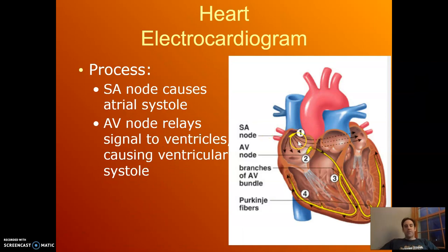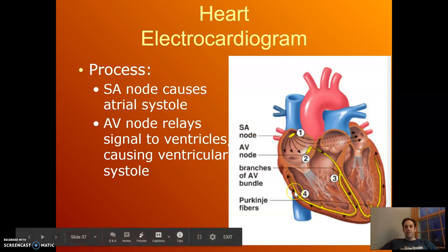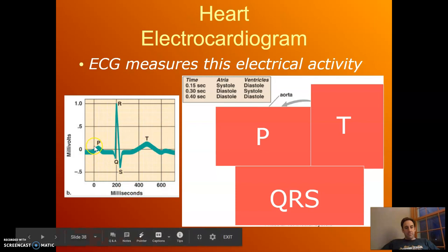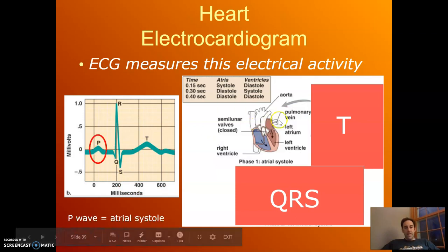The SA node causes the atria to contract, which is atrial systole. The AV node relays that signal to the ventricles, causing them to contract, which is ventricular systole. And so the ECG is simply measuring this electrical activity. And so that first little bump, that P wave, is the atria contracting. So remember, the atria are muscles, it's cardiac muscle. Action potentials are traveling through that muscle in order to cause them to contract. And so action potential is sodium ions rushing in, potassium ions rushing out, it's electrical activity. We're just measuring that electrical activity, and it's this little bump of the P wave.